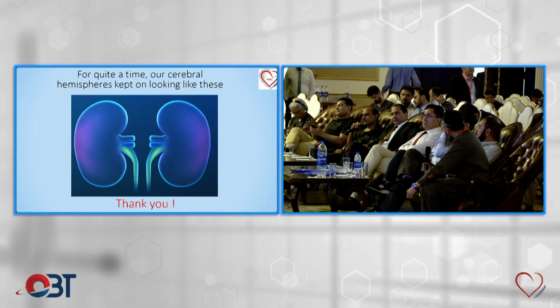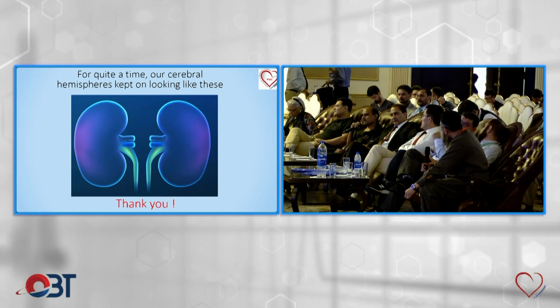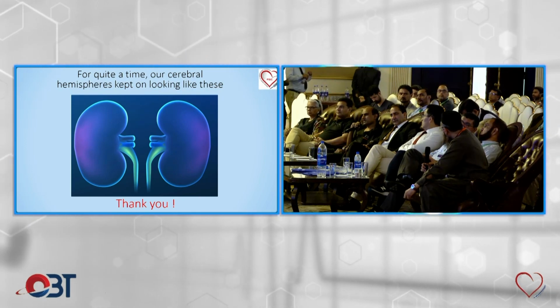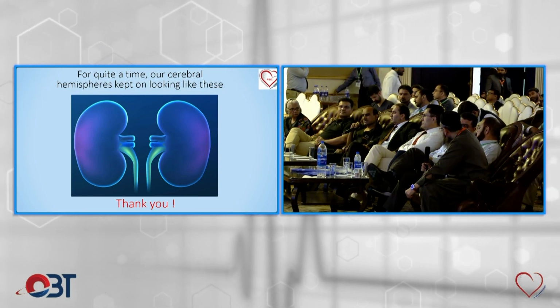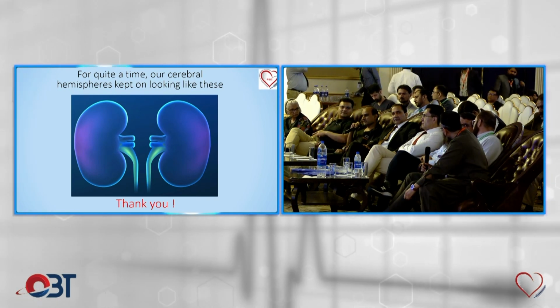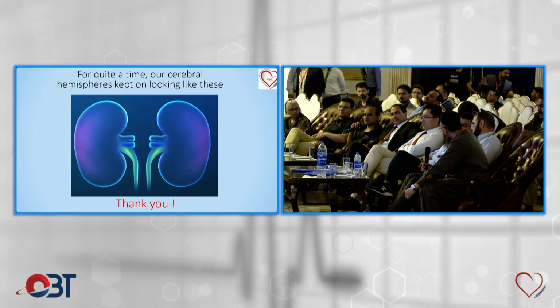So your comment would be an excellent thought that you have to use. Well, but the quality of fluoro, even on this screen you can see, and the cine which have been saved, I think that was reasonable. One of the images I remember where Dr. Jalal put on the screen is while crossing into the side struts from the middle, crossing with the BMW from the middle struts, most of the struts were visible, so it was reasonable. Personally, some of the operators I see use a lot of 30 frames or StentBoost. We have it in the machine. Even if I have it, I usually do not use it.